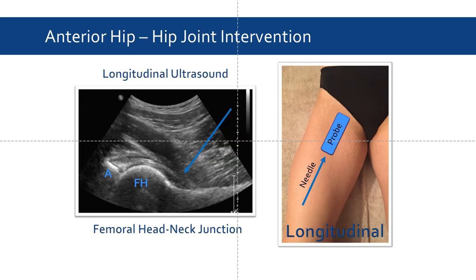If it is suspected that an effusion is indeed present, we can use the longitudinal view of the anterior hip to insert a needle using an in-plane approach, as demonstrated here as well as in the following video clip.